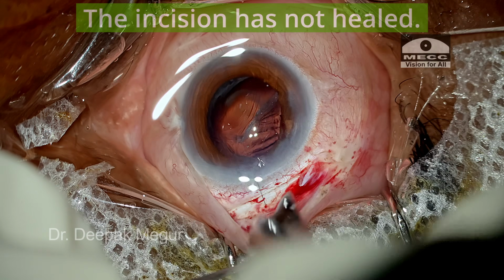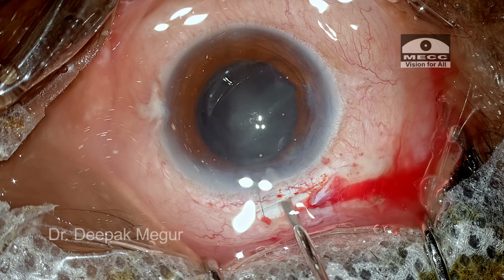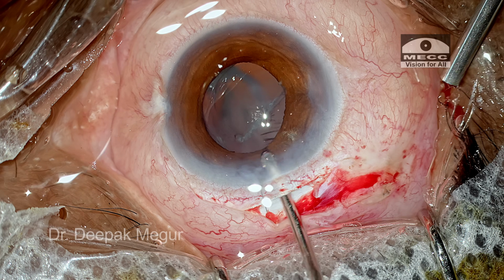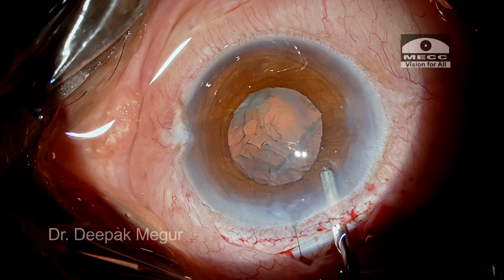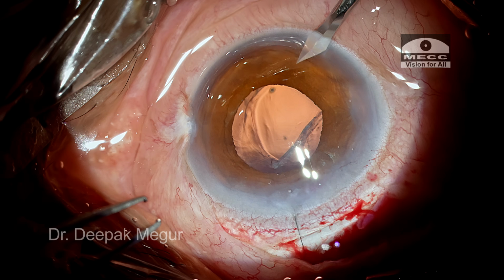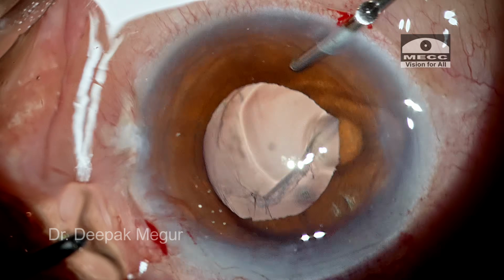But before filling in the OVD, I just want to put in some diluted triamcinolone acetate to check the presence of vitreous and in what area it is more. So there's a reason I first push in triamcinolone acetate, then irrigate it out, and then this is the area where the vitreous fibrils are seen, and then I'm going to put in the OVD. Once the globe is formed a little bit, I'm going to make two side ports. The right side port is away from the main phaco incision, and the left side port is beside the scleral tunnel incision. So the first thing to do is obviously to do the vitrectomy.